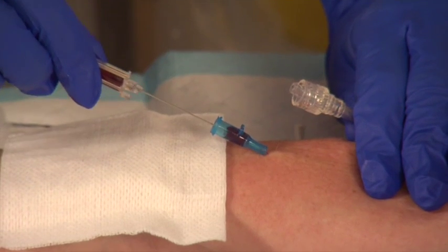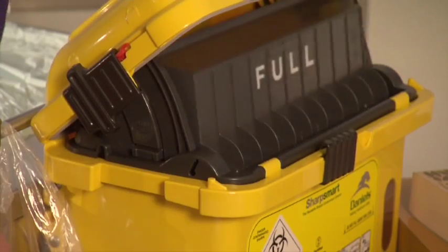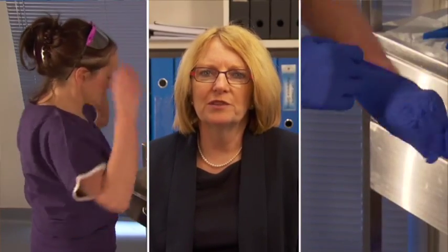It's also important to acknowledge that a potential risk exists for healthcare workers when performing this procedure, through exposure to blood and bodily fluids. Clinicians must always ensure that personal protective equipment is worn correctly and appropriately. Please take time to study the Alfred Health guidelines, which present strategies to minimise these risks and the steps to be taken if exposures occur.